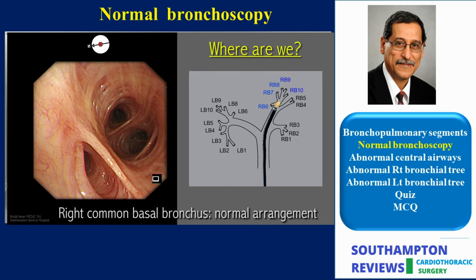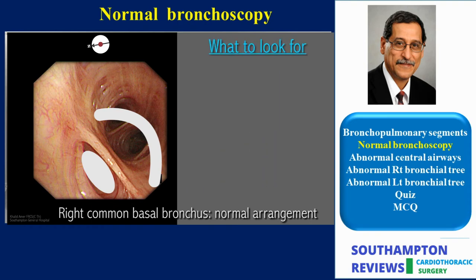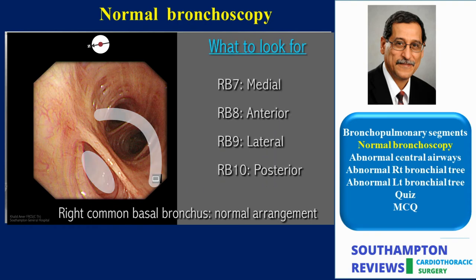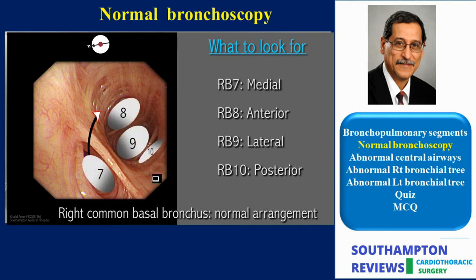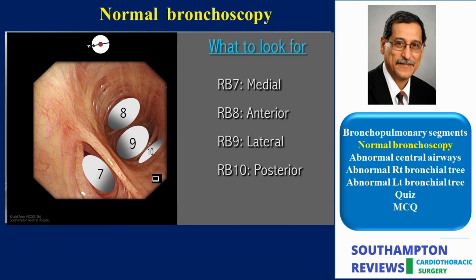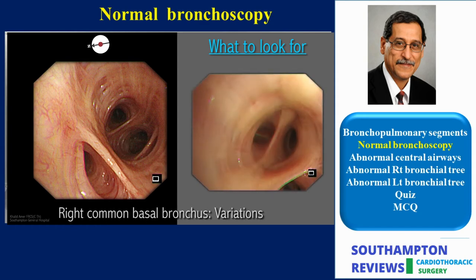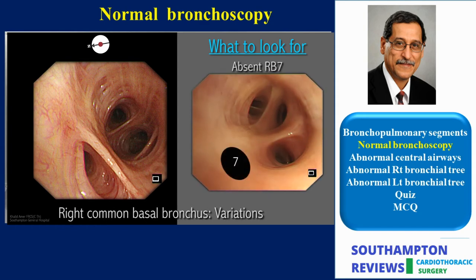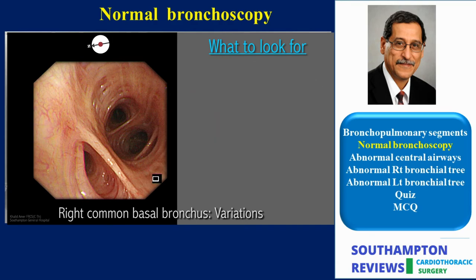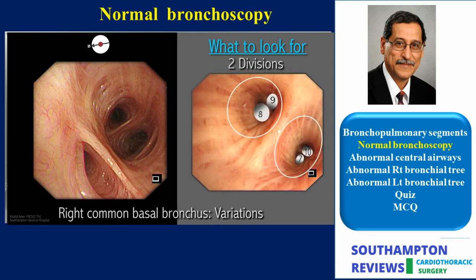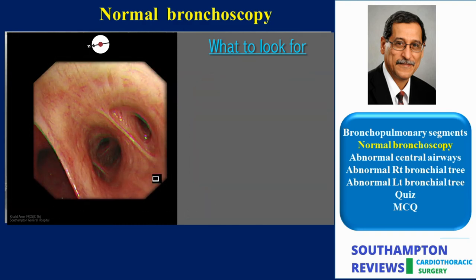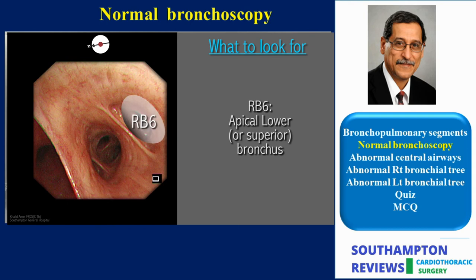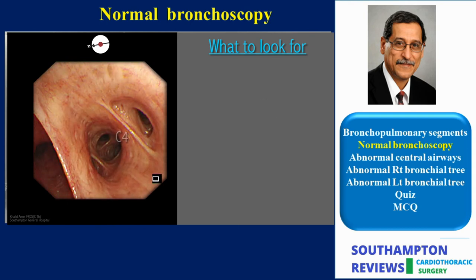One should expect a crescent of three orifices separated by a sharp carina from a single orifice facing its concavity. These four orifices are named in clockwise order as medial basal, anterior basal, lateral basal, and posterior basal. Divisions of the common basal segments show great variation, the commonest being absence of RB7 and two sets of double divisions. On proximal withdrawal of the scope, the takeoff of the apical segment RB6 should be seen, separated by a sharp quaternary carina from the common basal segments. This concludes examination of the right side of the tracheobronchial tree.